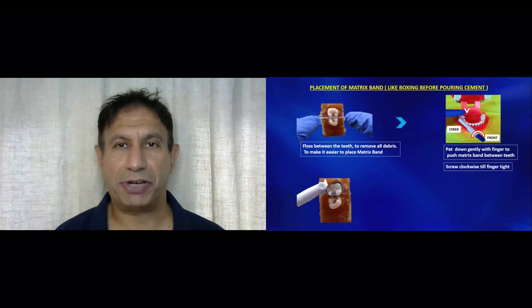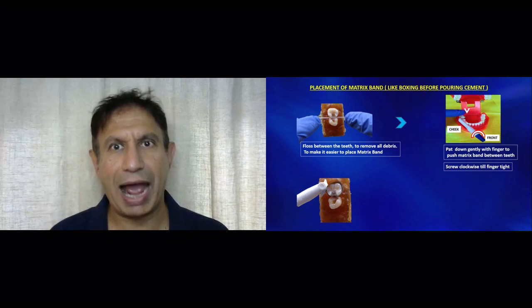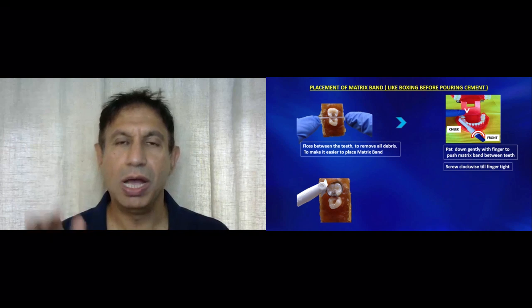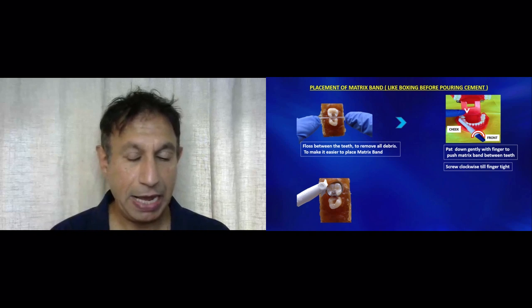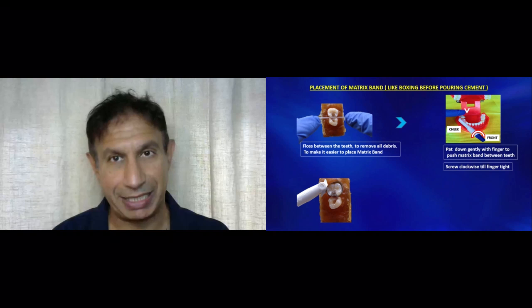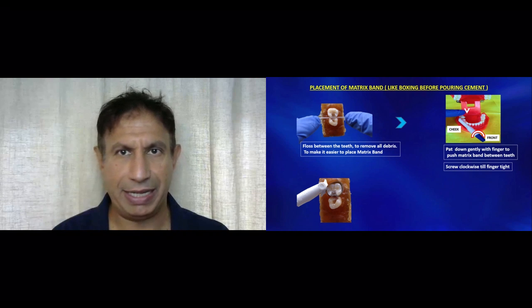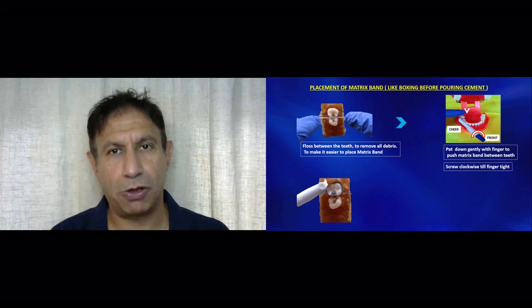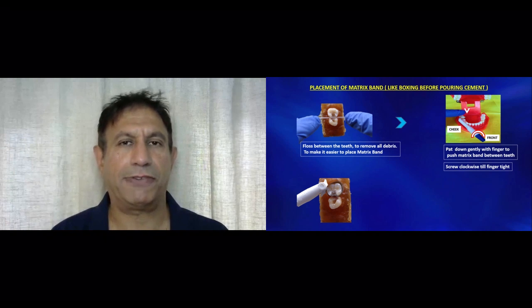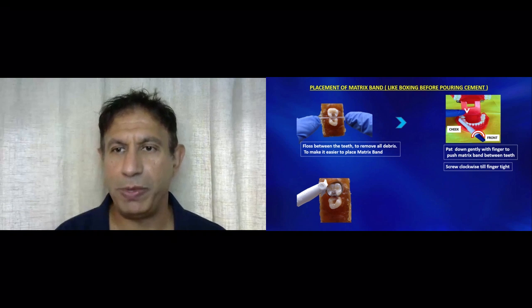Next, if you have a matrix band — basically, if a part or a wall of a tooth is broken, we can use this metal ring to surround the tooth to act as an artificial wall against which you pack your filling material. This band also dries and isolates the tooth to a certain extent. If you don't have this band you can just push your filling in, that's still fine. But if you have this band, because it isolates the tooth and gives you an artificial wall to pack your filling against, it is worthwhile to use it.